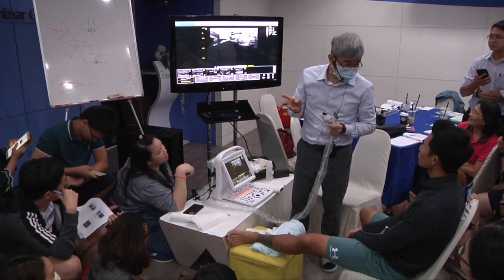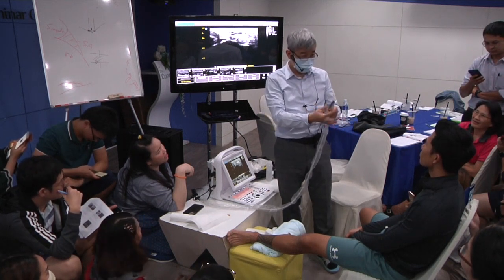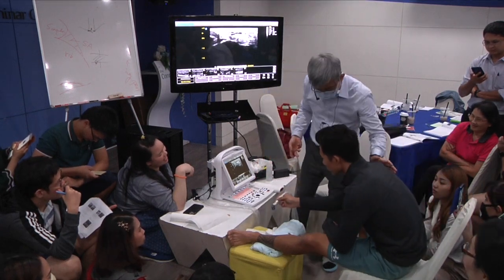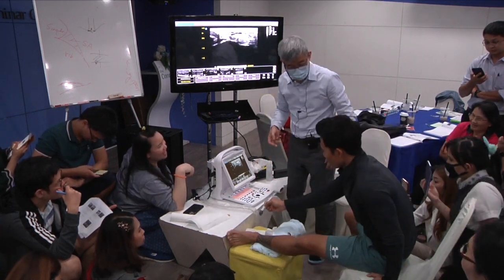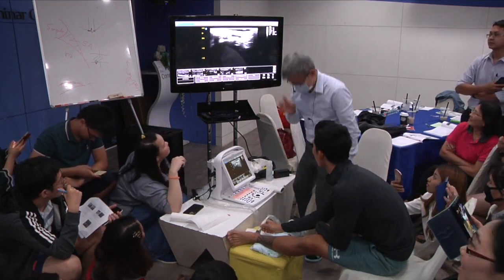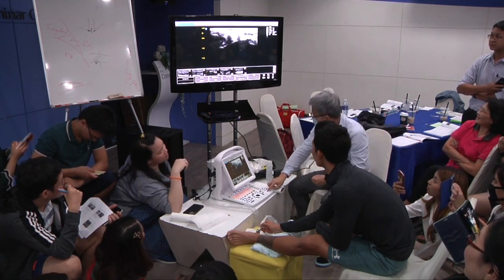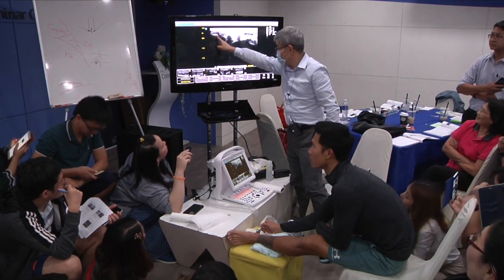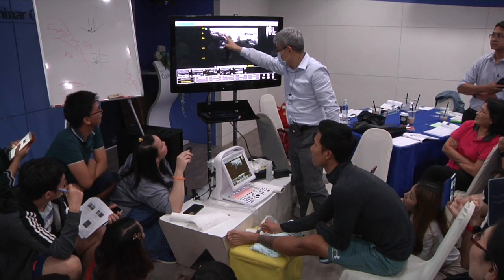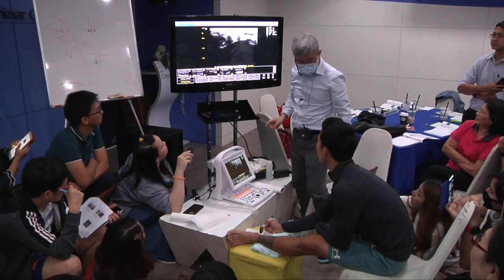Find the medial side. Practice. Hold the probe. Yeah, look at your tibia posterior. I know you have very good mobility in the back. I will be your assistant. Good. Medial collateral ligament. Medial malleolus. Tibia posterior. The flexor digitorum is not clear, right?